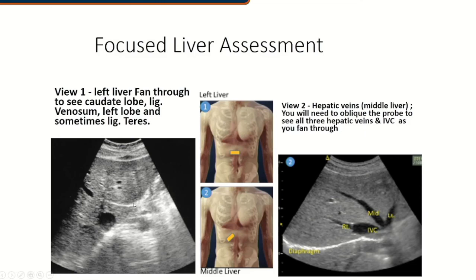And then your second image would be looking at a multi-segmented lobe of the liver using the hepatic veins to divide the left lateral lobe from the left medial lobe, and then the left lobe more largely from the right lobe, and we come into the right anterior, and then finally that right posterior lobe.